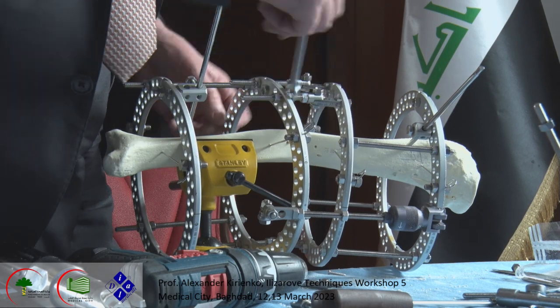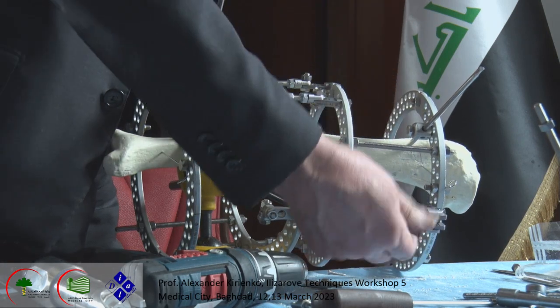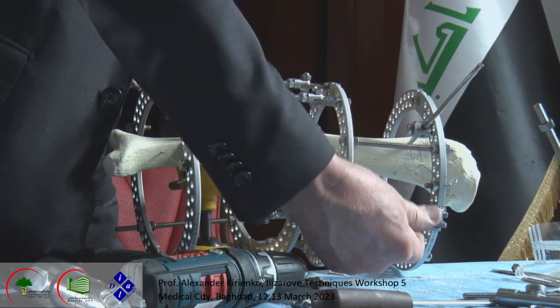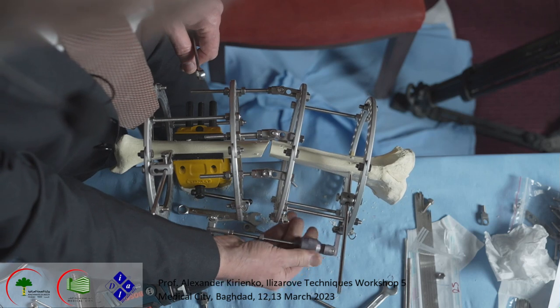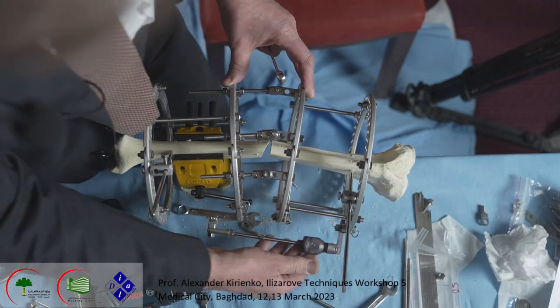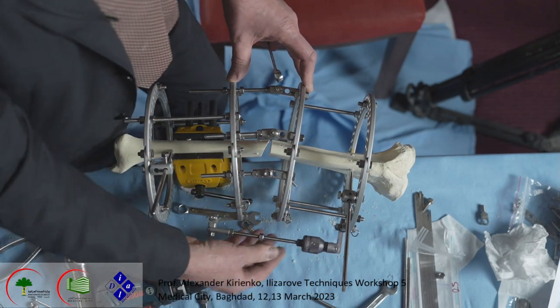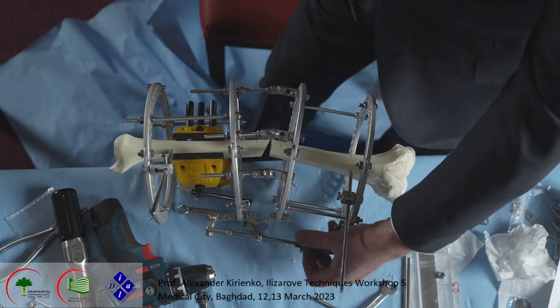You see, it is going good. Lengthen, okay. Everything is going functionally, okay. And look at the bone. You see now the bone starts to open more and more.